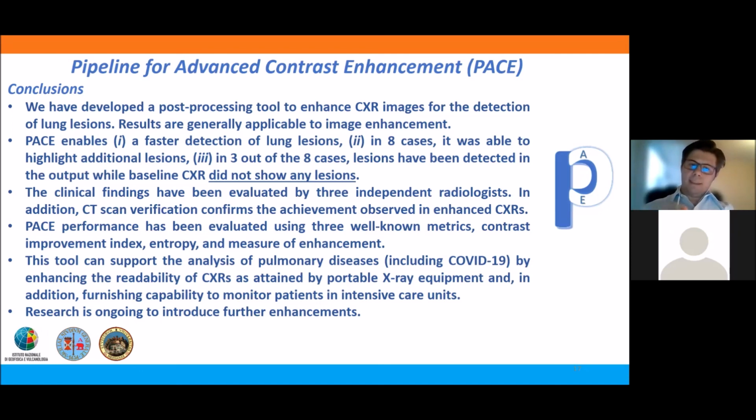The clinical findings have been evaluated by 3 independent radiologists. And in addition, CT scan verification confirmed the achievements observed in the enhanced chest X-ray images. Furthermore, PACE performance has been evaluated using 3 well-known metrics, and this tool can support the analysis of different pulmonary diseases, including COVID-19, by enhancing the readability of chest X-ray images as obtained using portable X-ray equipment.